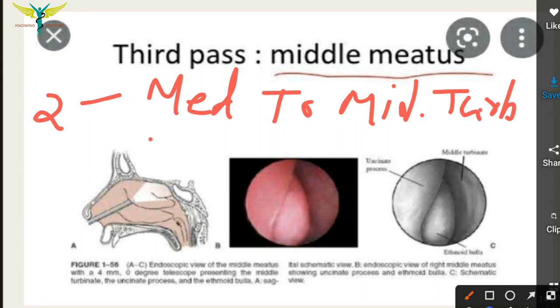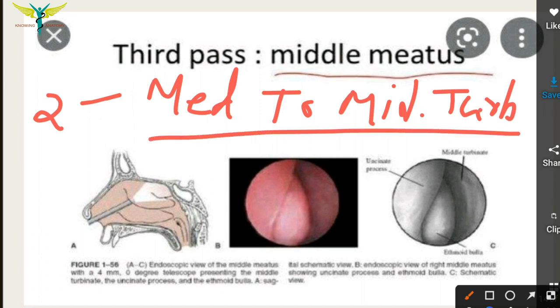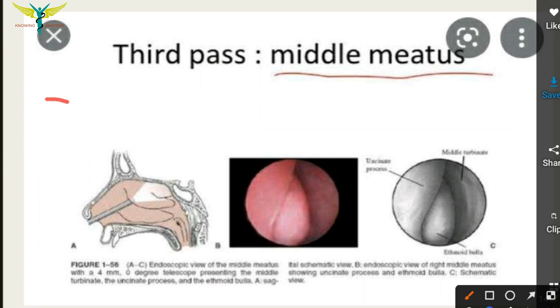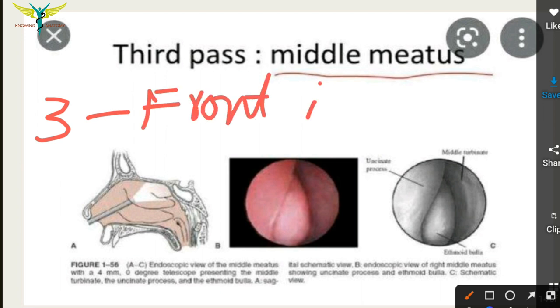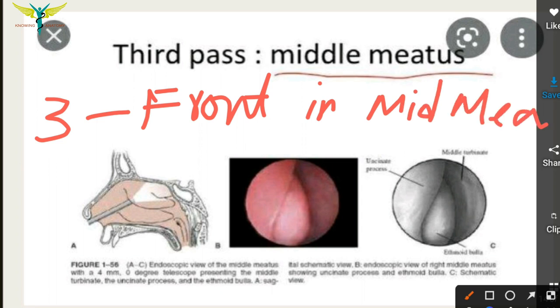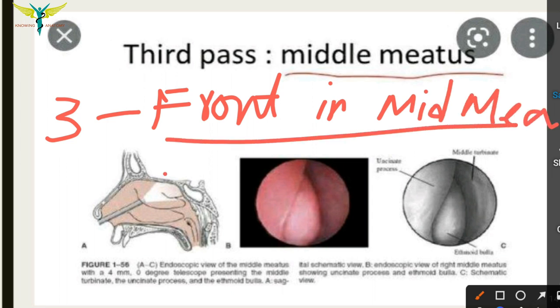In the second pass we observe the sphenoidal recess, superior meatus, opening of the sphenoidal sinus, and posterior ethmoidal cells. In the third pass, the endoscope is passed from the front into the middle meatus to examine the osteomeatal complex in detail, as shown here with the endoscope and the light illumination.